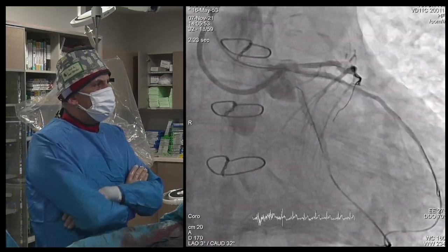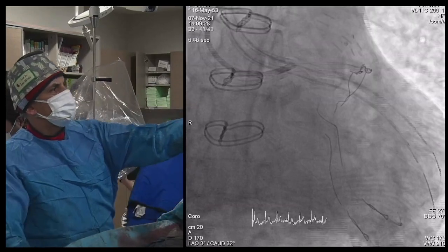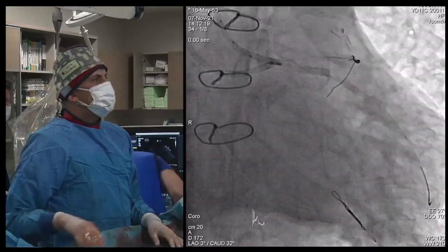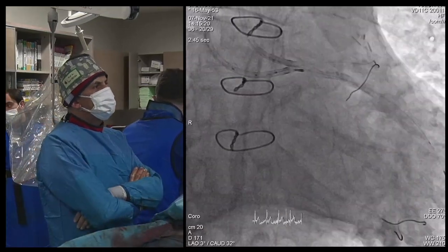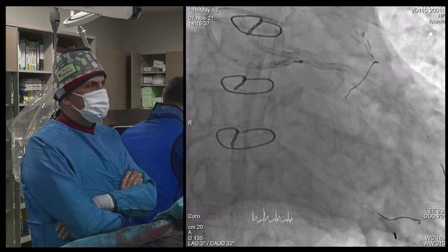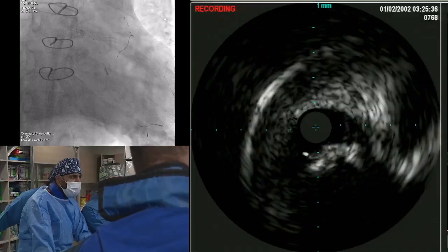We discussed this with the audience and moderators. After dilatation, we had some dissection at the proximal part, but that's okay — that part is the CTO and we don't care about dissection there. We tried to go antegradely. The eyeball view showed us we are in the subintimal space — we are under the strut, for sure. We did 3.5 and 4.0 dilatation for the OM stent.